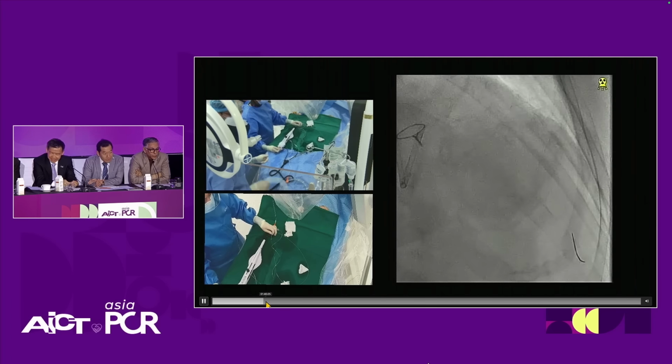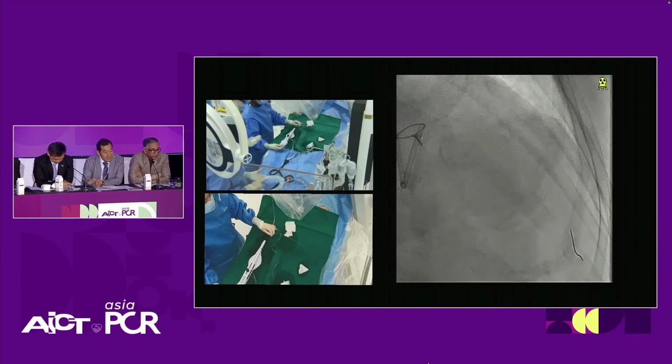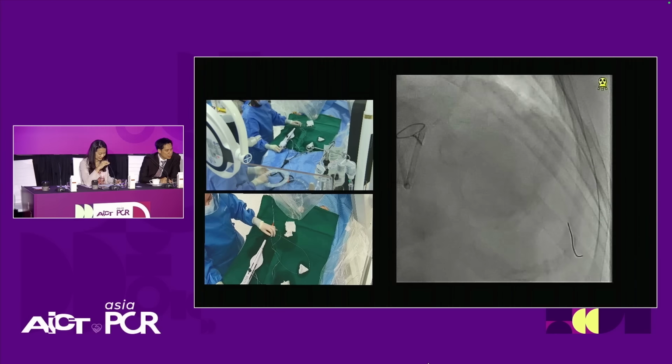Okay, Hui Wen, you're doing something here. This is your master technique, I think. Yeah. So this is a one-hand rota, advanced rota ablation.